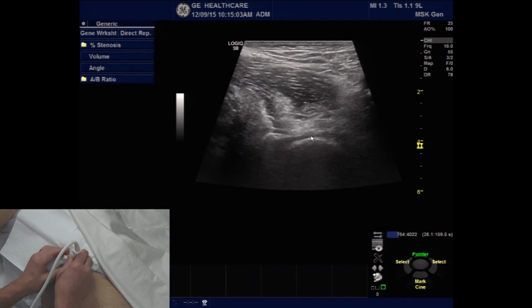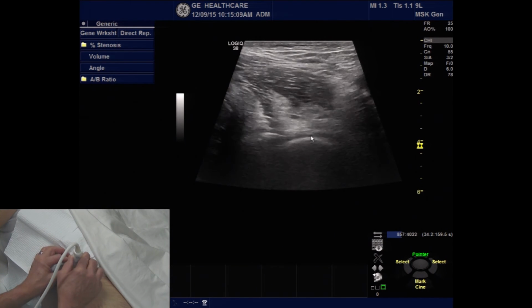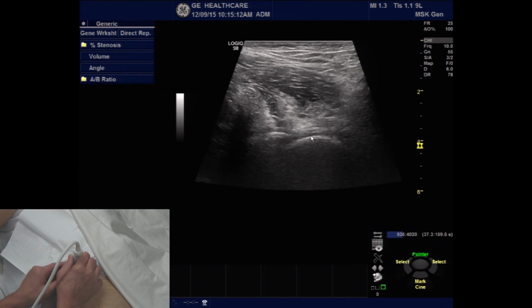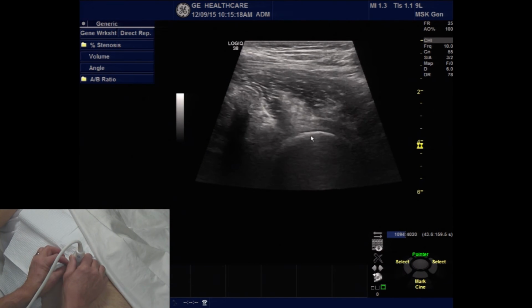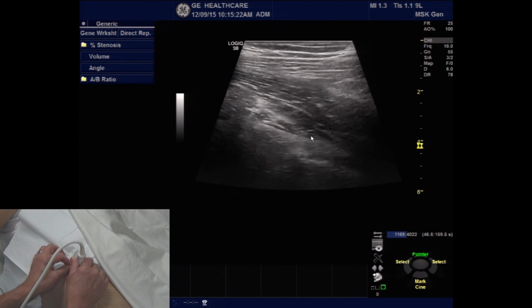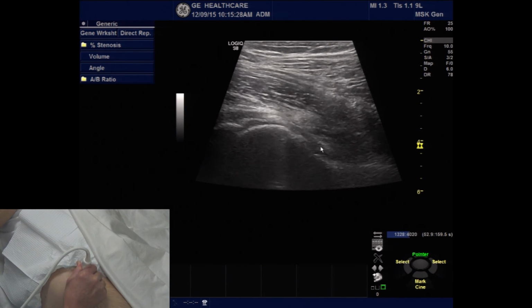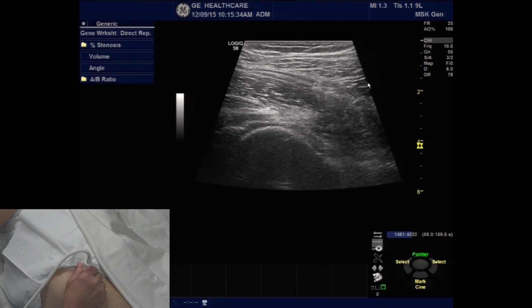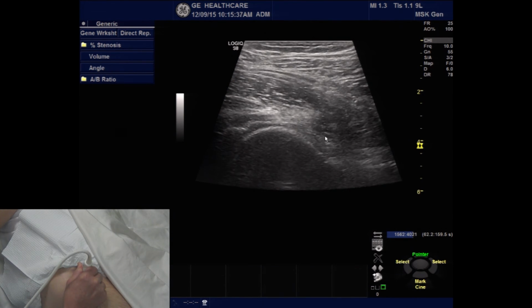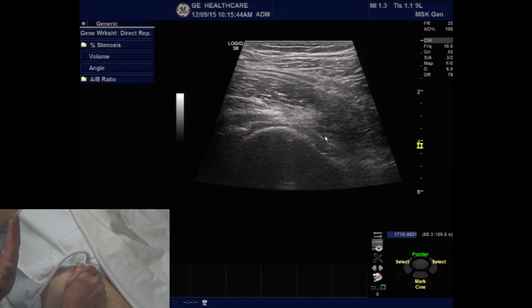Turning the transducer from the short axis, a nice technique is to point the area of the transducer landmark or orientation marker to the contralateral shoulder. So as I simply turn the transducer in a clockwise fashion, I can get down to the area of the anatomic location of the anterior capsule of the hip, and I would be able to guide my needle into that anterior capsule from a lateral to medial approach. The orientation marker at this point is approximately between the patient's contralateral ear and shoulder.